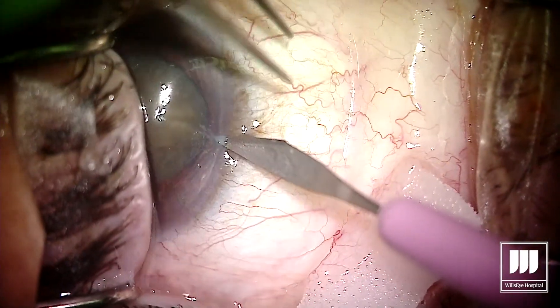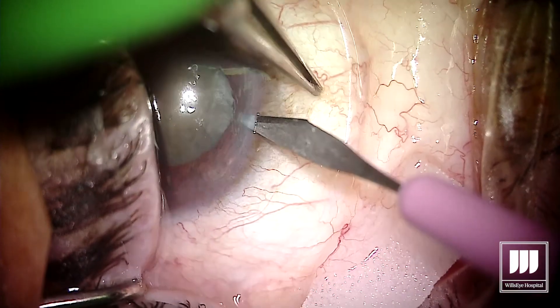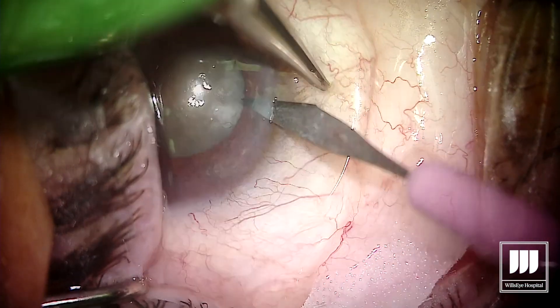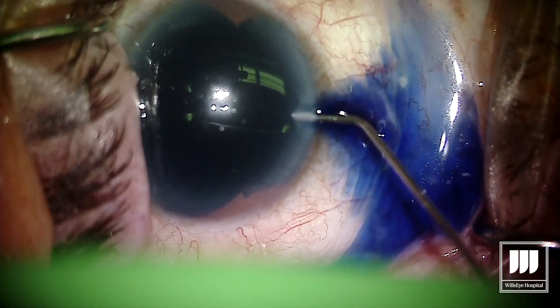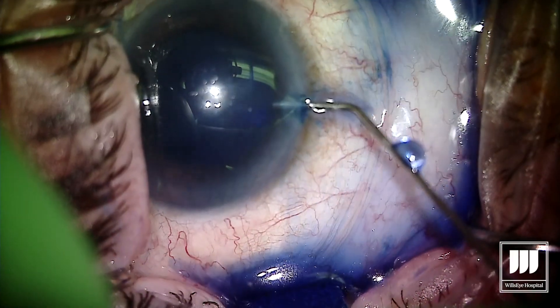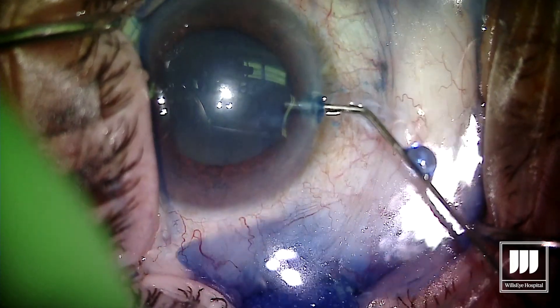Clearly what you can see in the video is a leathery brown hypermature cataract. This patient also happens to be monocular, and my goal was to try and keep our incisions as small as possible and still get this cataract out with as little phaco energy as possible.